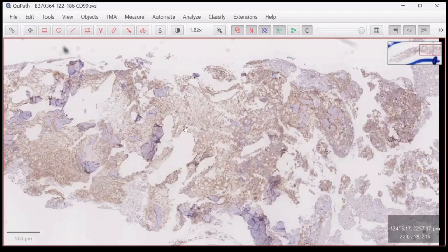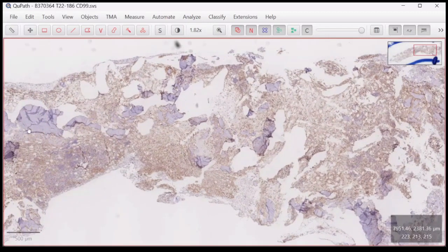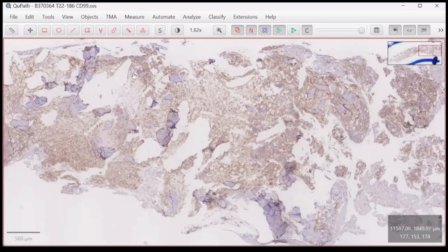Because just now we saw two patterns. In general, we saw patchy areas of proteinaceous edematous stroma with proteinaceous material, and a predominantly recovering, regenerating marrow with normal adipocyte fat spaces and also erythroid colonies and a megakaryocyte population.